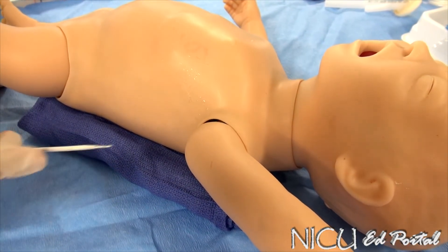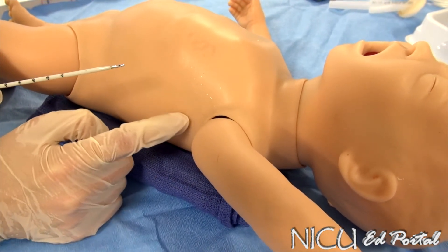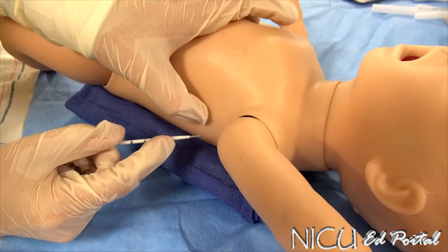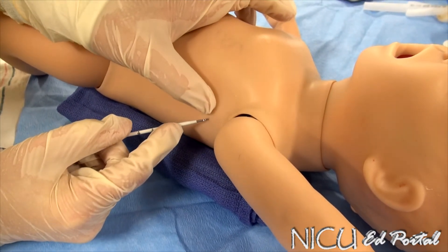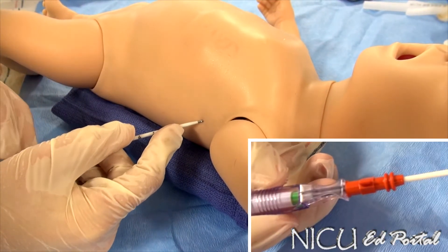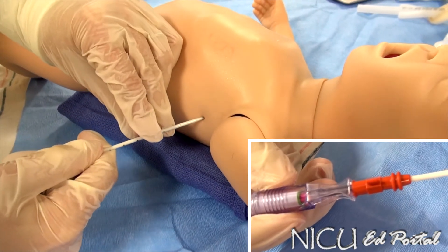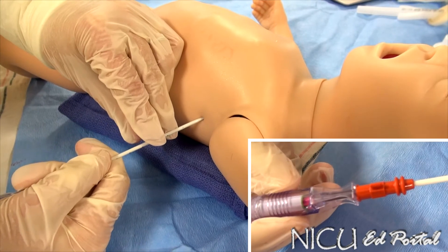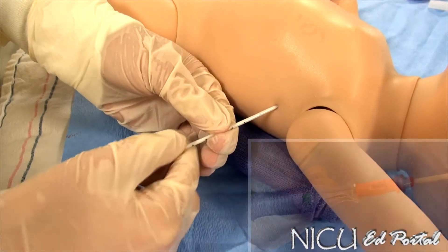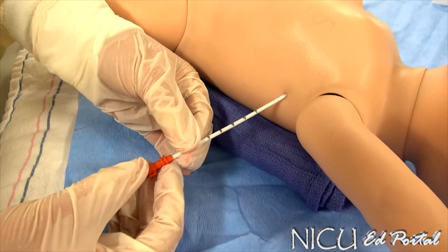We will now insert the chest tube. Again, identify your landmarks. You go directly above the rib and go until you see the hub turn green. You will then want to insert your chest tube another 2 to 3 centimeters.